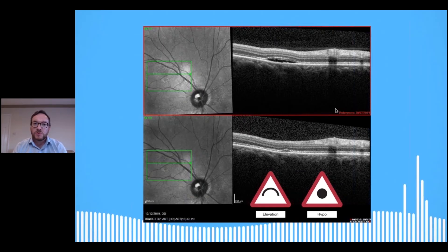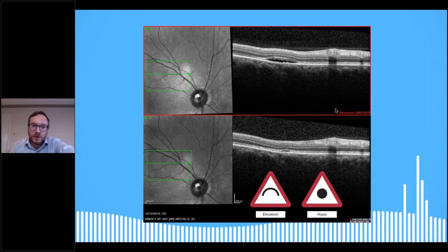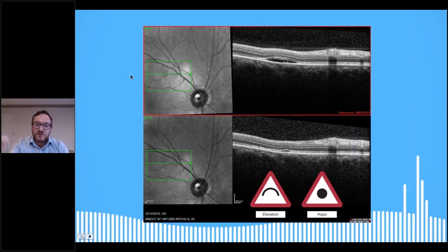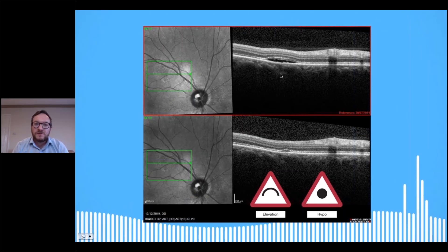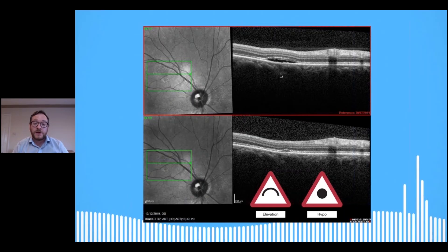This gentleman is now coming back to see me on a three-monthly basis on the recommendation of the ophthalmologist. We know that if it doesn't encroach, doesn't get any bigger or any deeper, and he's asymptomatic with no impact on his visual acuities, then we're just going to monitor this — basically it just waxes and wanes. The Spectralis is excellent for this because it locks onto the retinal fingerprint and allows you to re-scan exactly the same area. There are 56 line scans that make up that box, and you can set them to run as a movie — compare the two, take measurements, check if it's getting wider or deeper, are you symptomatic, are your VAs okay? If all that's okay, we just review and set up another appointment for three months.